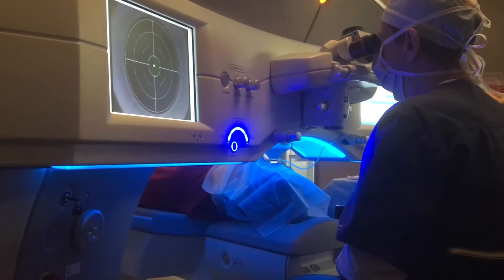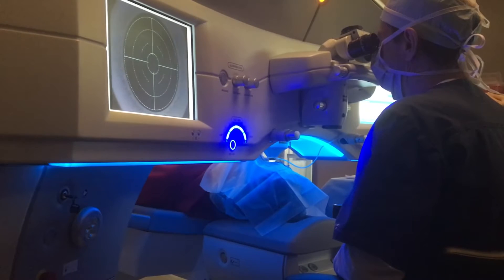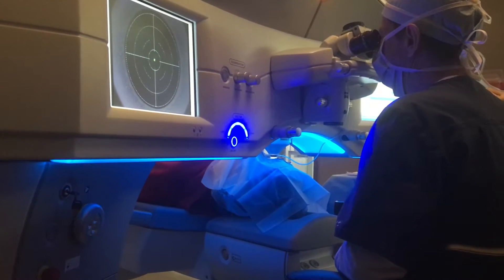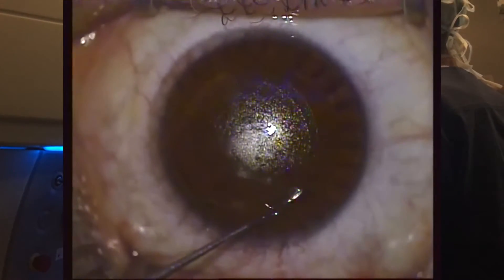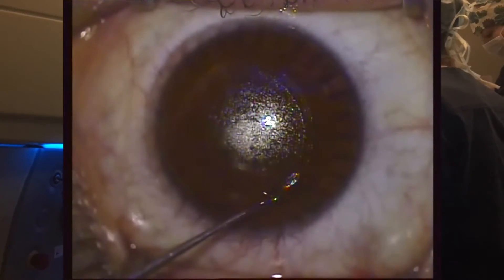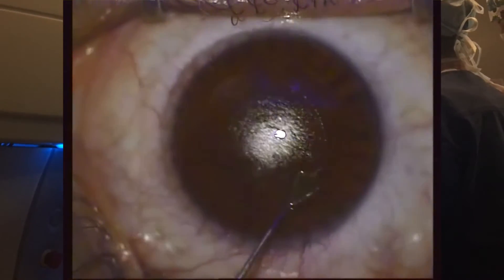Once this is all completed, the suction is released and the patient is lowered down and then moved to the treatment position. Here the patient is in the treatment position and I am using the RELAX dissector to first enter the small incision and define the two planes that I'm going to separate.